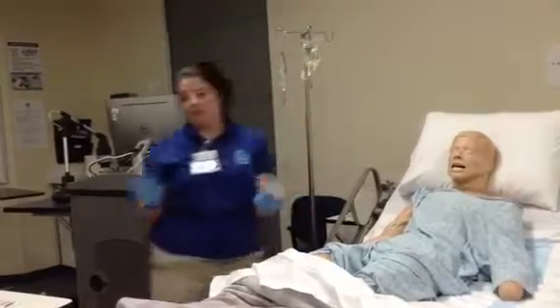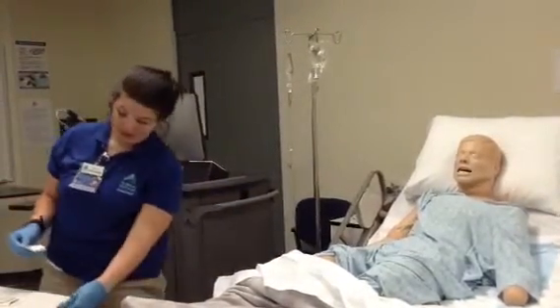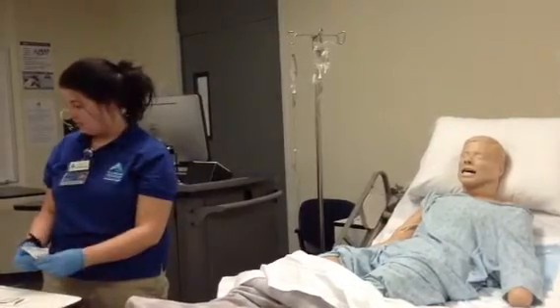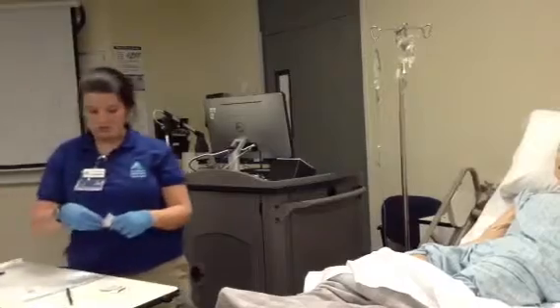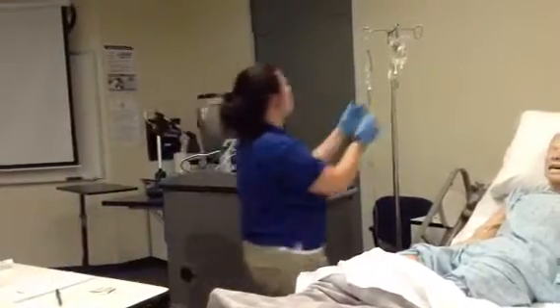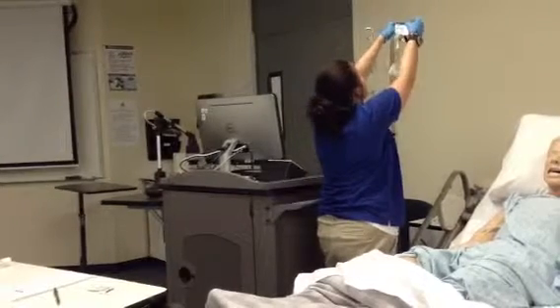And I would probably get my new drug label and put this back on. Get a piece of tape. Make sure that was on. But my bag needs to be facing the other side.